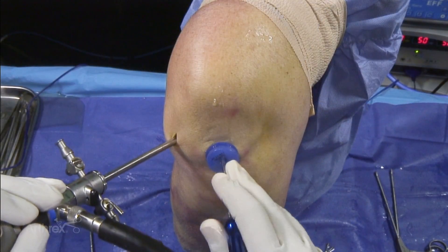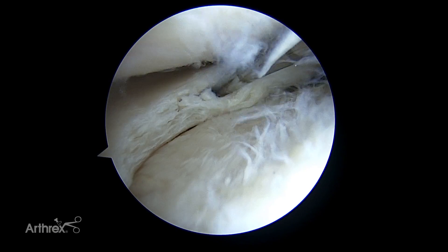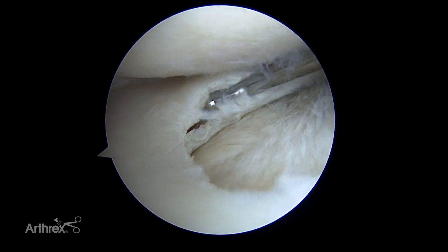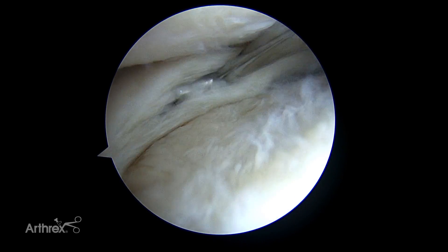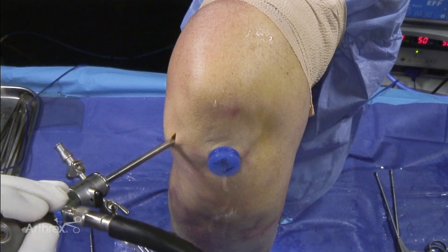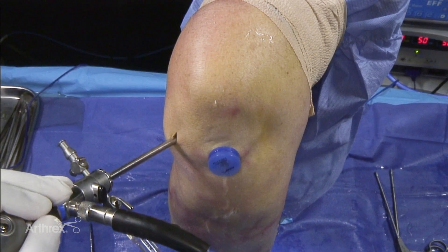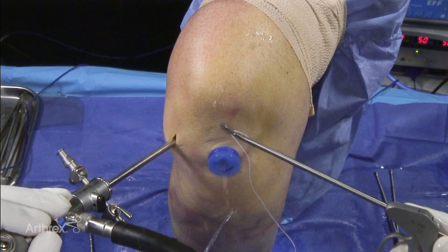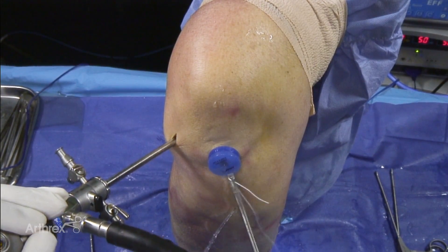This is a demonstration of using a Scorpion for circumferential repair of a horizontal tear in the meniscus. We're going to use the knee Scorpion, which is a low-profile device with a five-degree curvature.